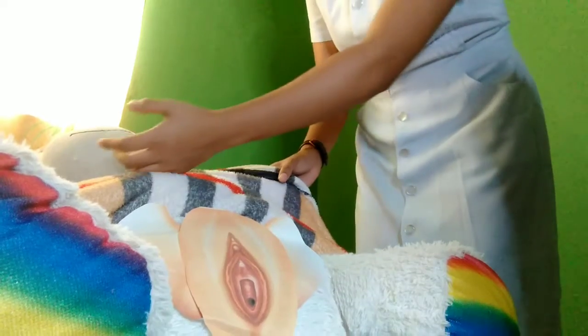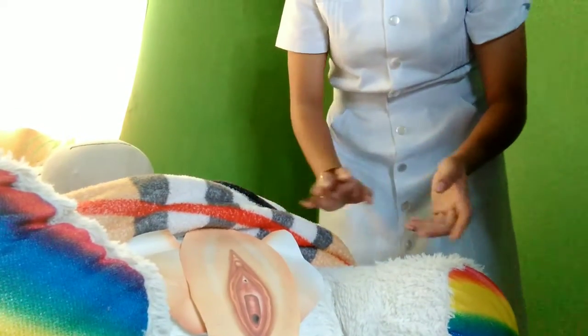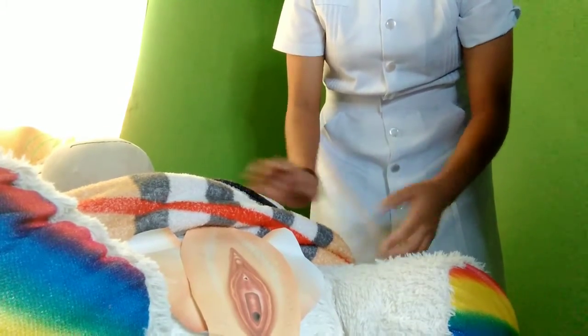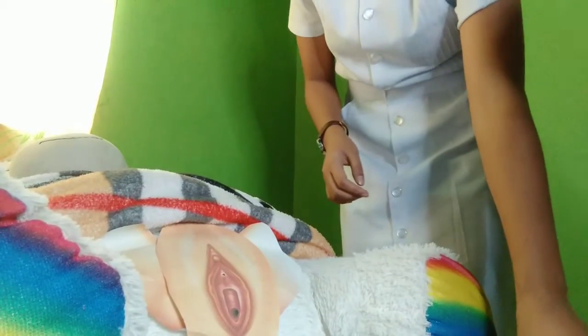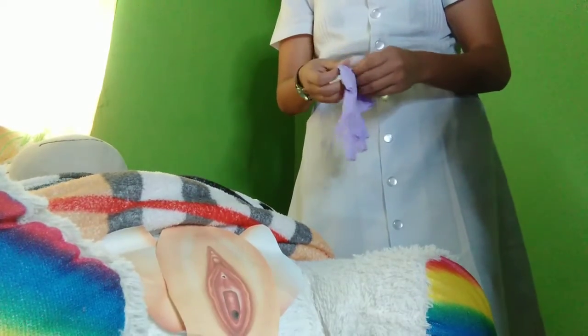So, place a blanket or sheet to cover the patient and expose only the required anatomical areas. This step helps protect the patient's dignity. So, apply clean gloves and wash the perineal area with warm water and soap or perineal cleanser according to agency policy.